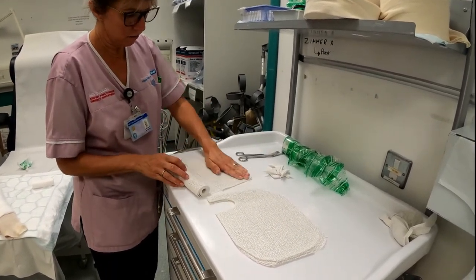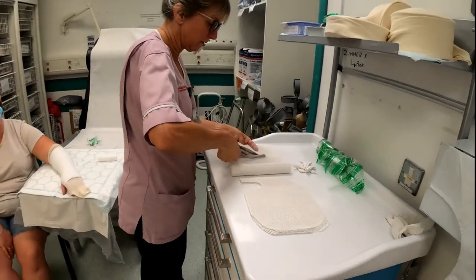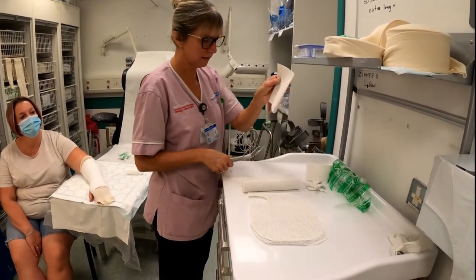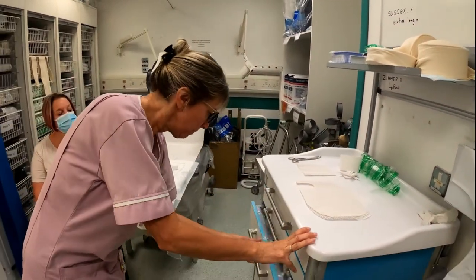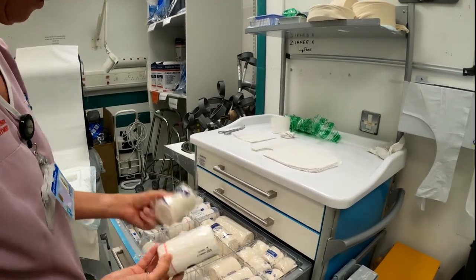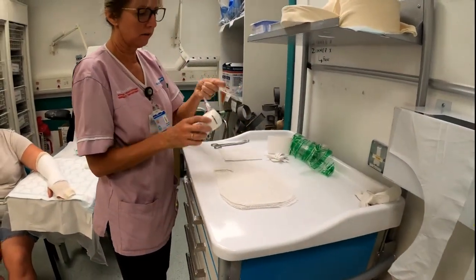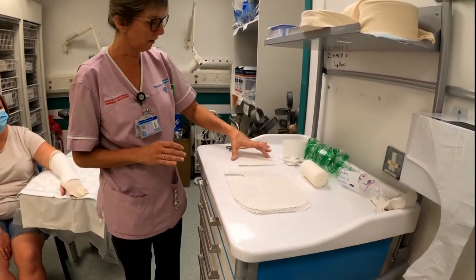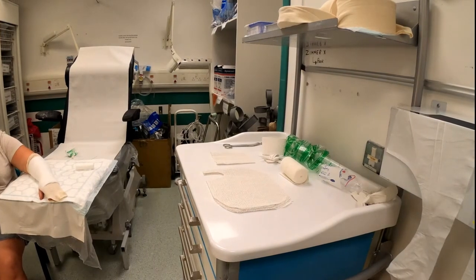Before you start your application, prepare another two-layer piece which will go on top of the bandage to secure it. We don't tend to use tape because it just gets wet and falls off. Also prepare your bandage — use the middle size again because the big one will be far too big to get around the wrist. Have all your materials ready to go: the slab, the bandage, and the little piece to secure the bandage. Put gloves on — it does get plaster everywhere.